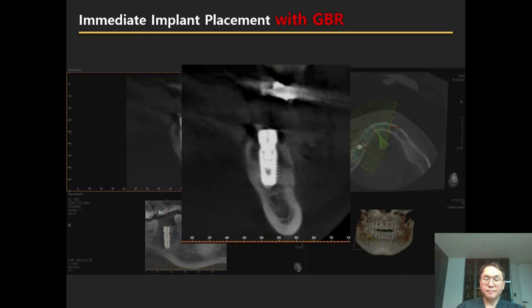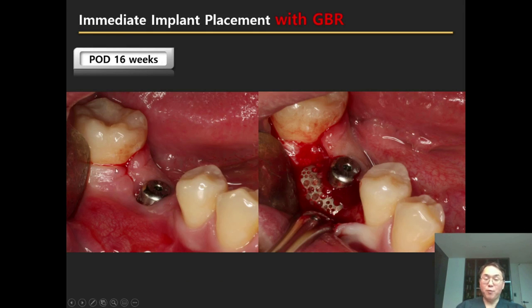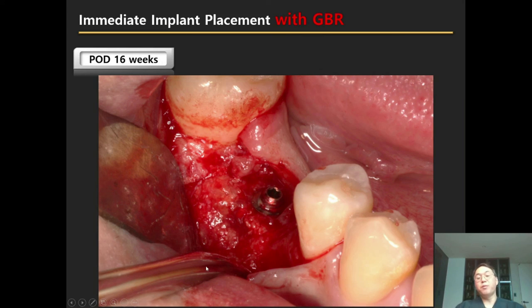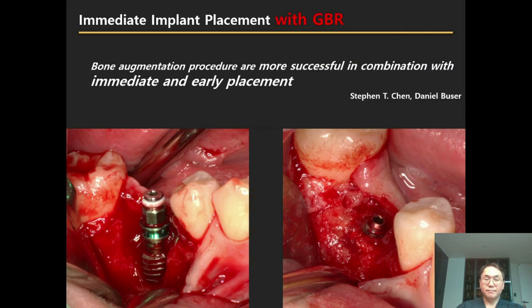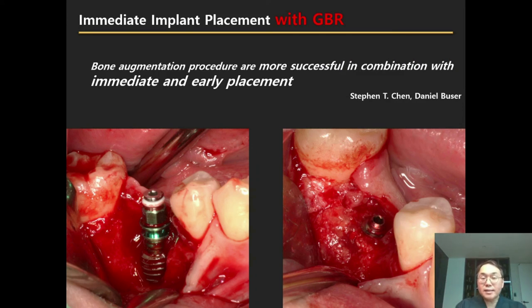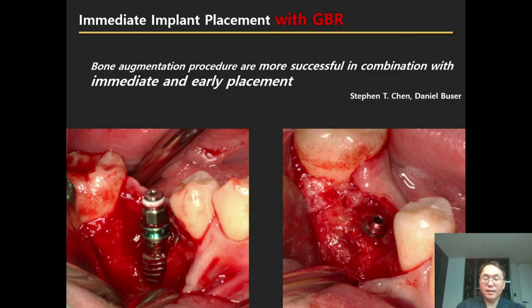Four months after GBR with Smart Builder, Smart Builder was removed. Upon opening the flap, beautiful bone regeneration was visible. Before and after comparison shows significant improvement. I like this transmucosal GBR because, as Steven Chen said, bone augmentation procedures are more successful in combination with immediate and early implant placement. During the healing process of the extraction socket, there is sufficient blood supply and bone-forming cells and signaling molecules, maximizing the success rate of bone regeneration.